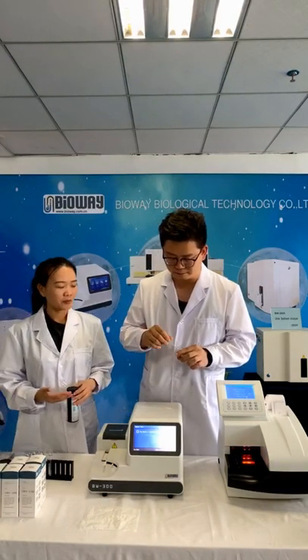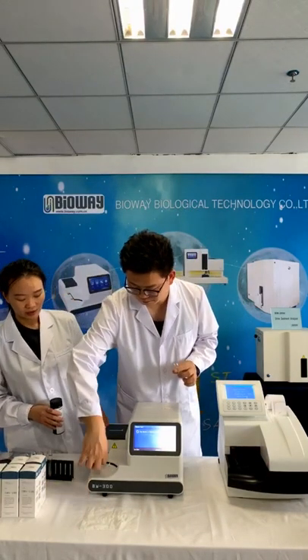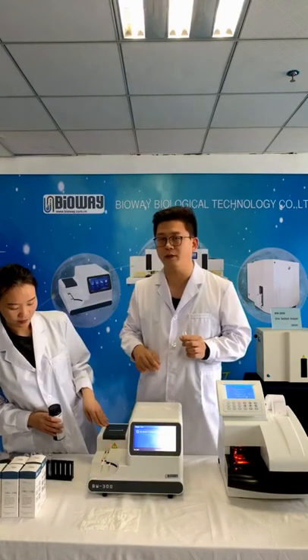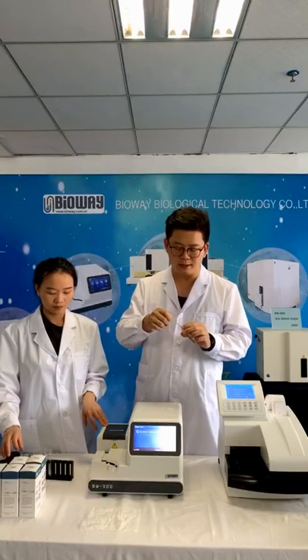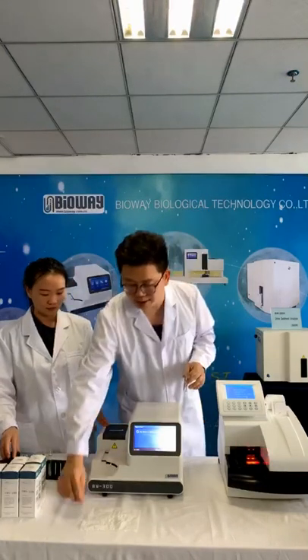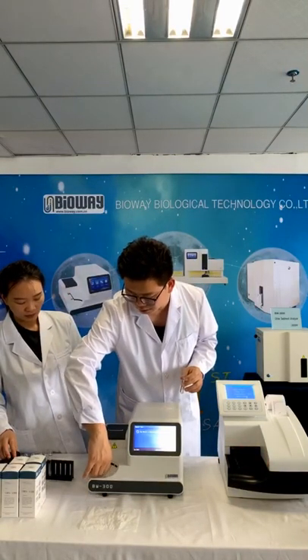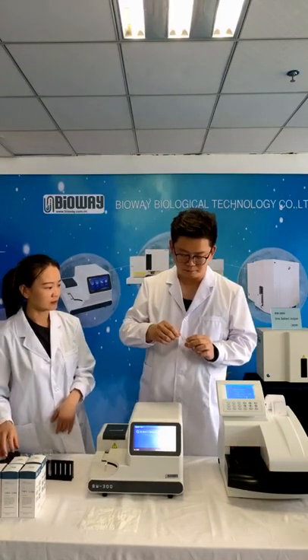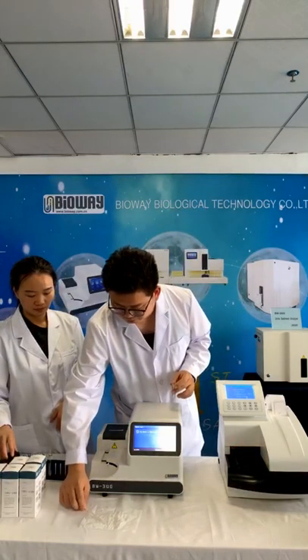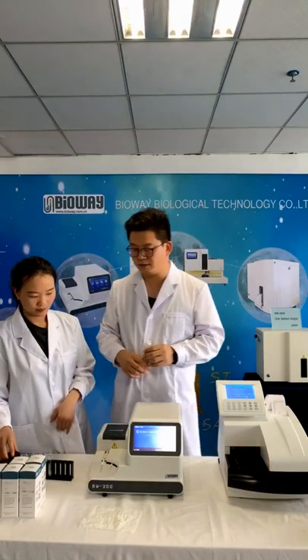And you don't have to put the strips very straight because the machine can fix it. But the point is, I suggest you place the strip above both of the belts, because there are two belts here. Yes, there are two parallel belts. This is the high-speed test machine.